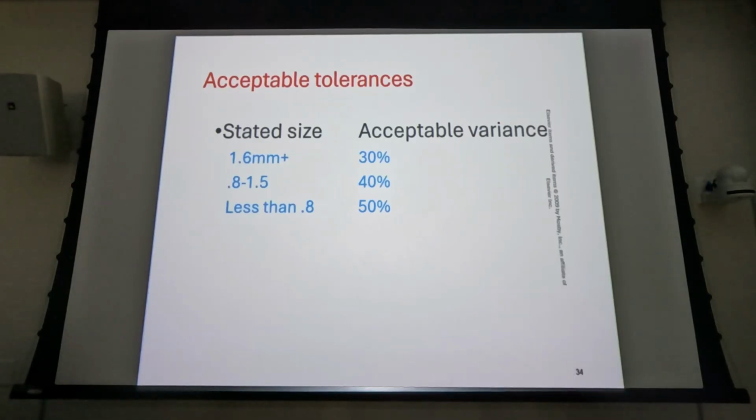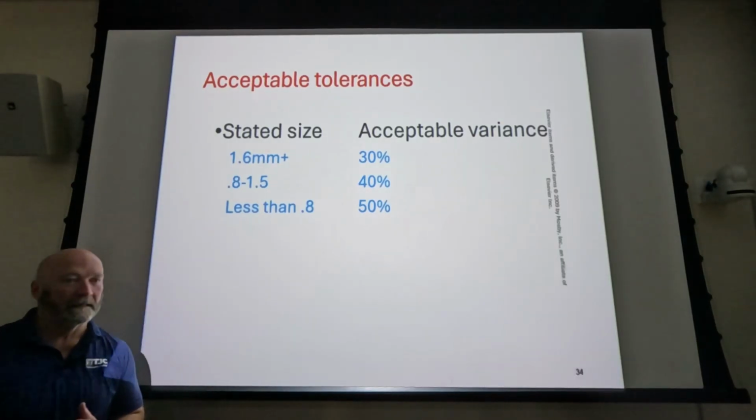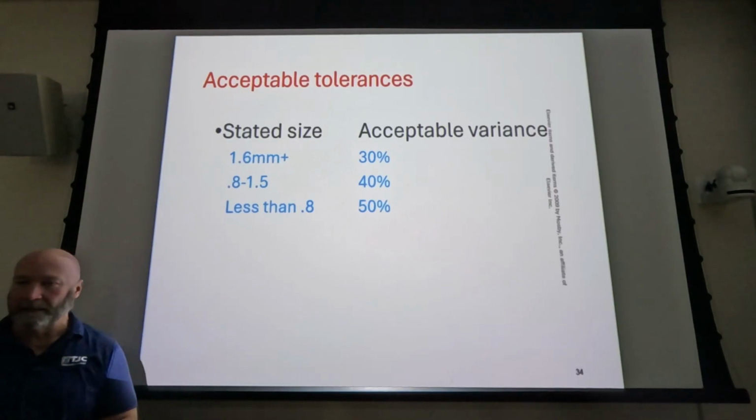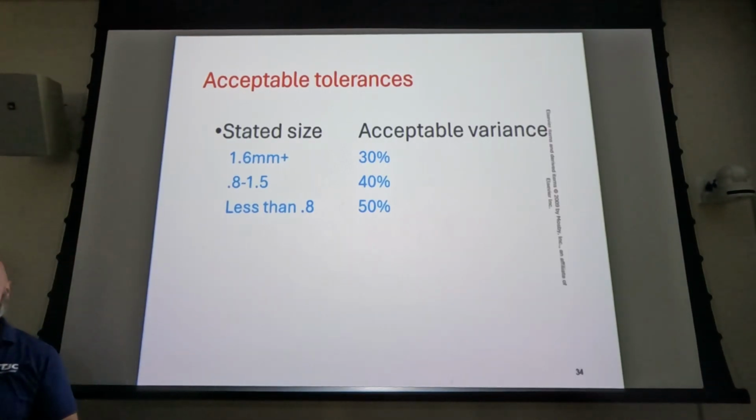So, we're going to talk about this again in your sophomore year. Everything that we do, every setting that we have, kVp, mA, time, focal spot size, SID, beam perpendicularity, collimation, everything has a quality control test. So your mA stations should be accurate and should be proportional to the next mA stations.